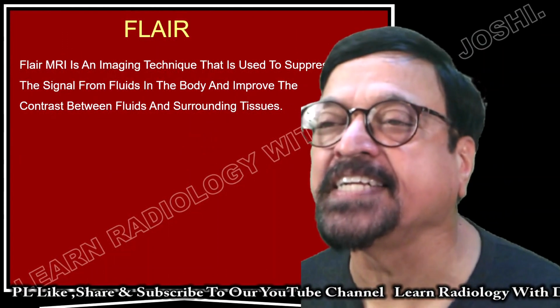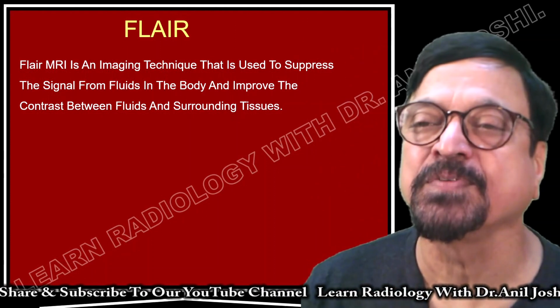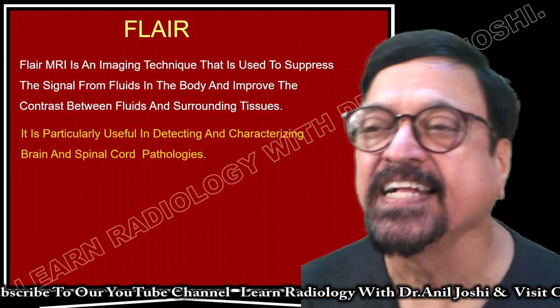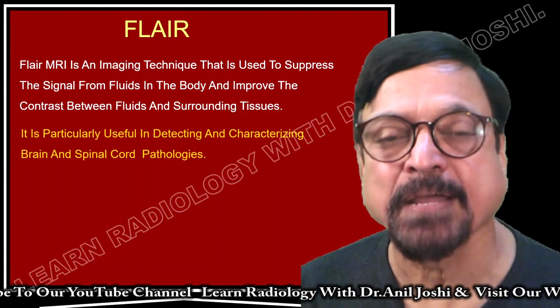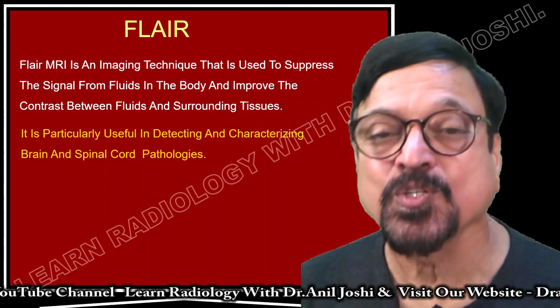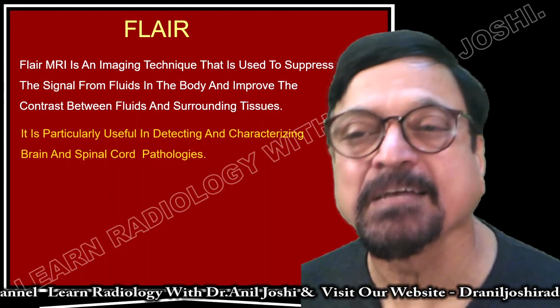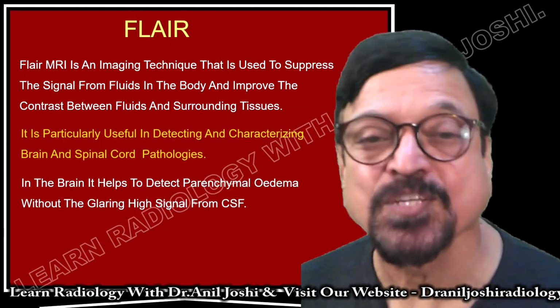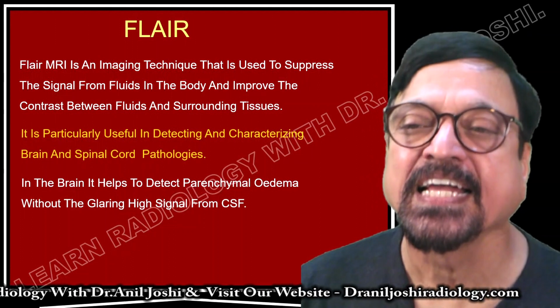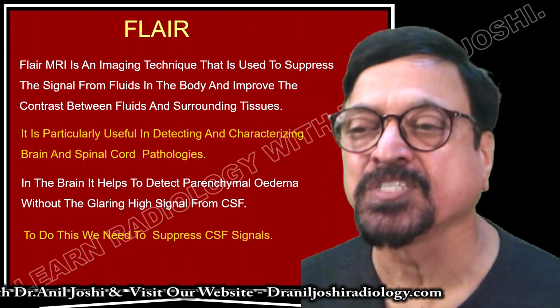FLAIR is an important imaging technique that is used to suppress signals from the fluid in the body and improve the contrast between the fluid and surrounding tissues. It is particularly useful in detecting and characterizing brain and spinal cord pathologies. Why? Because if CSF spaces are also disturbing with the same signal as surrounding tissues, it will be difficult for us. So, we can suppress the CSF signals, and that is what is required. Now, in the brain, it helps to detect the parenchymal edema without glaring high signals from CSF. It can differentiate from them. To do this, we need to suppress the CSF signals.